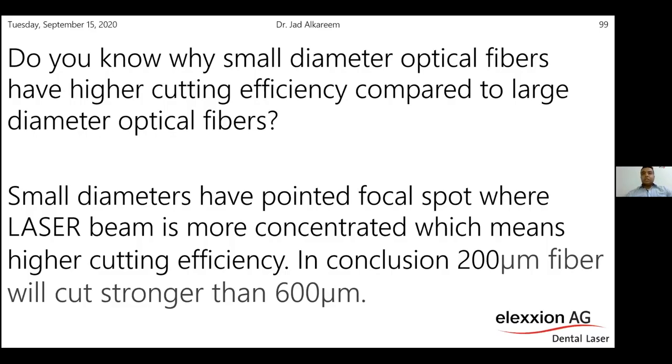So this is just for your knowledge. It is similar to the X-ray that you use in your clinic. X-rays with a small focal spot will have better penetration into the tissue compared to X-rays which have larger focal spots.